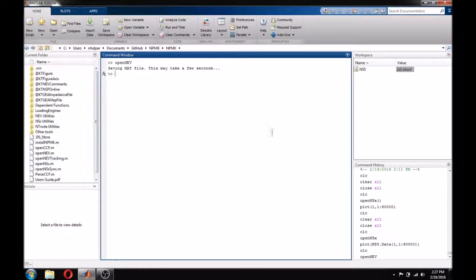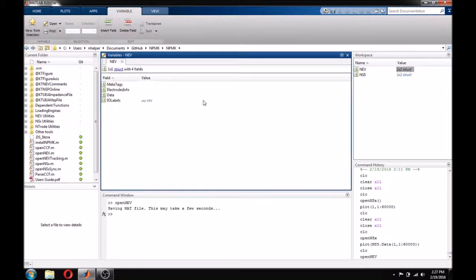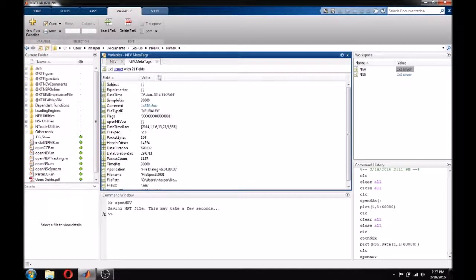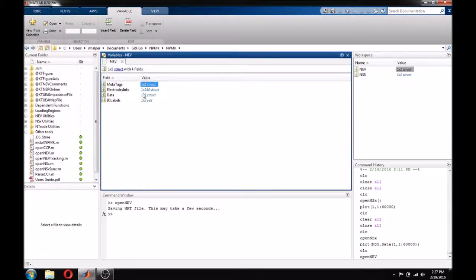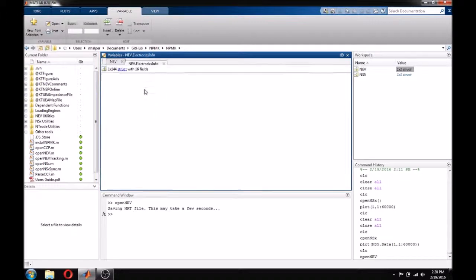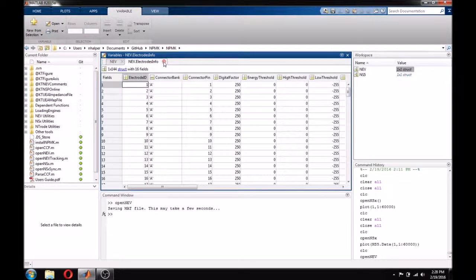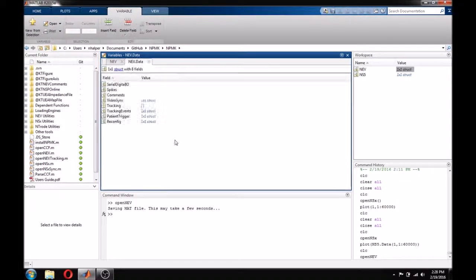The NEV structure contains similar looking fields to the NSX structure. Metatags contains a number of the same fields as we saw in the NSX structure. ElectrodesInfo also contains the same information. Data is actually a structure that contains a number of substructures that contain different types of data.